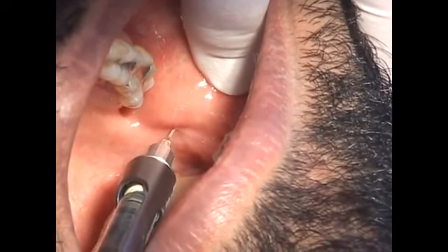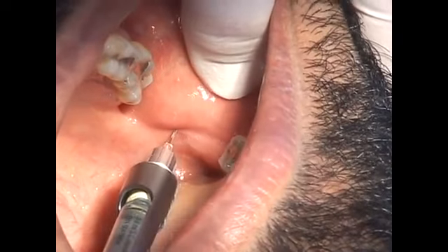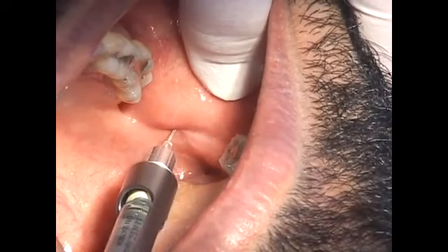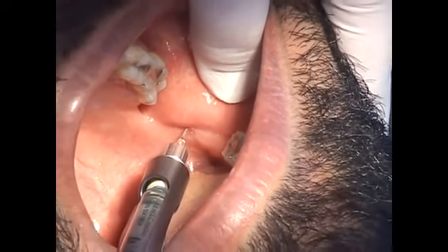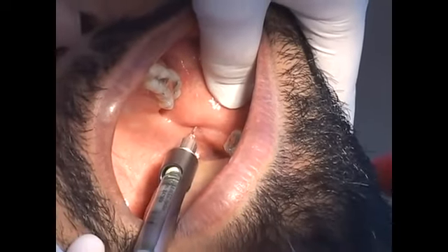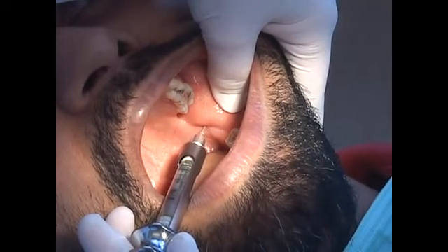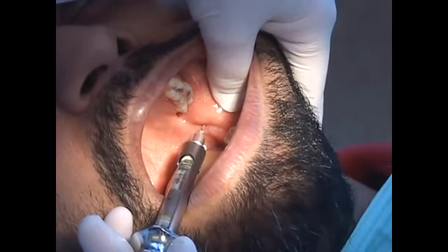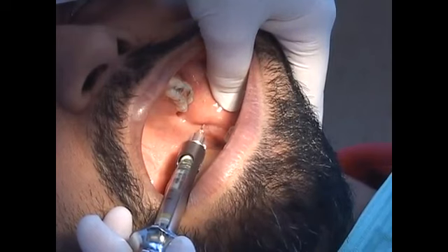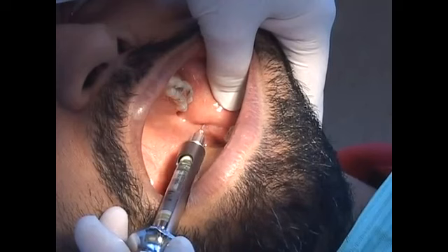Bony contact is essential to ensure the needle has not been advanced posterior to the ramus. This is the location of the parotid gland and the facial nerve. Injecting anesthetic into the parotid gland capsule could anesthetize the facial nerve, which is the motor supply for all the muscles of facial expression. Instead of anesthetizing the teeth, temporary unilateral facial paralysis would result.